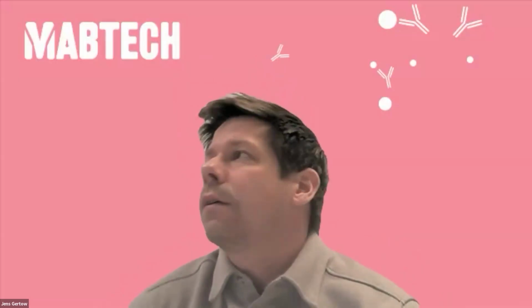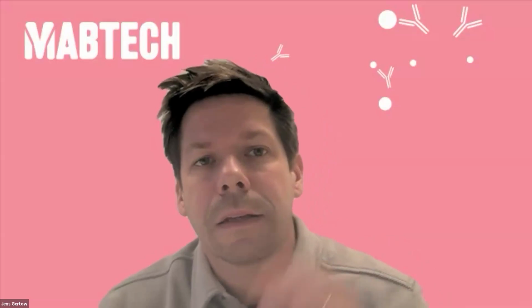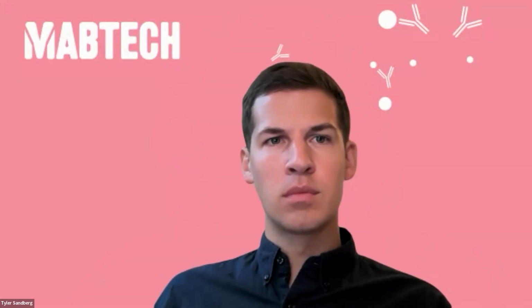Right. We are using buffy coats mainly in-house from the blood banks, and I have to double check with our scientists whether those are CPDA collected from the beginning. I'm actually not sure, but we will come back to that. So it should be EDTA tubes for a molecular analysis. If you're interested in the RNA, DNA, or transcriptomics, we would recommend lithium heparin if it's the cellular component, the adaptive immune cells, you're interested in.